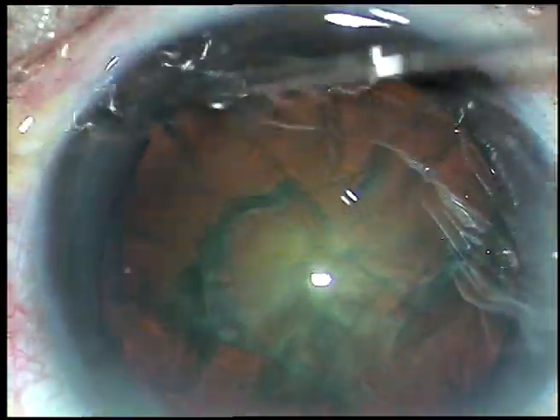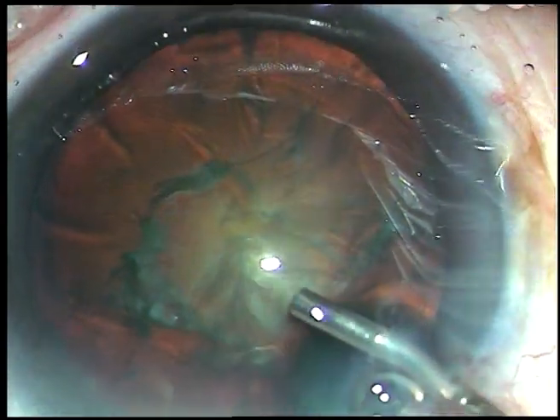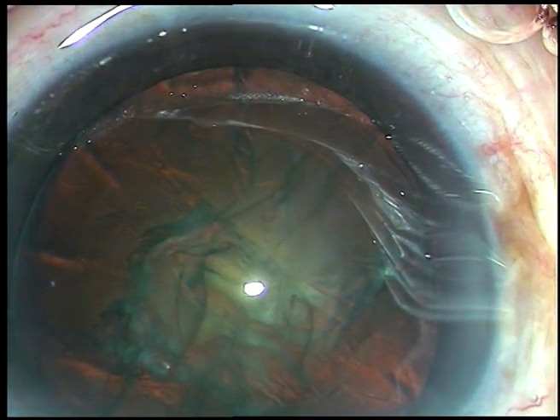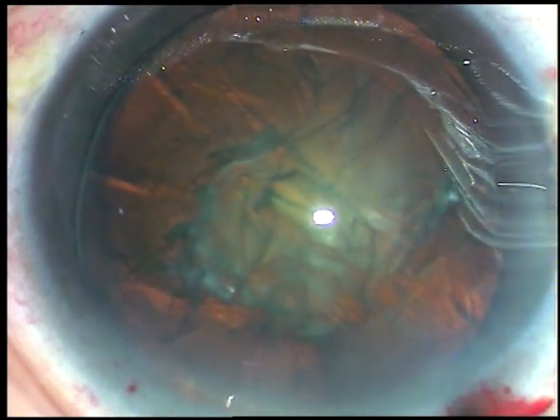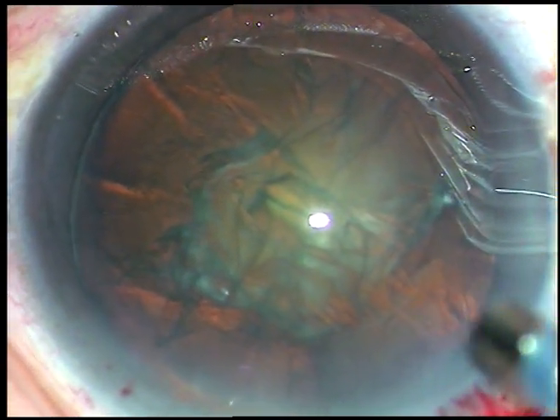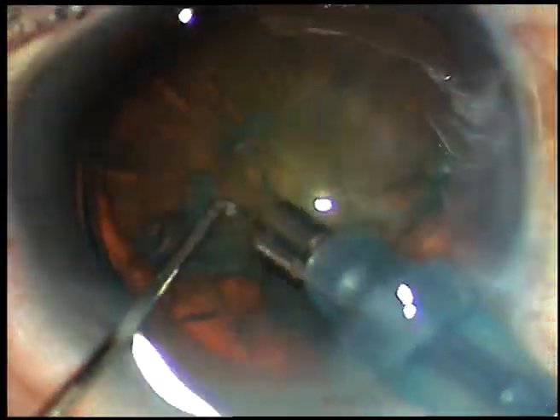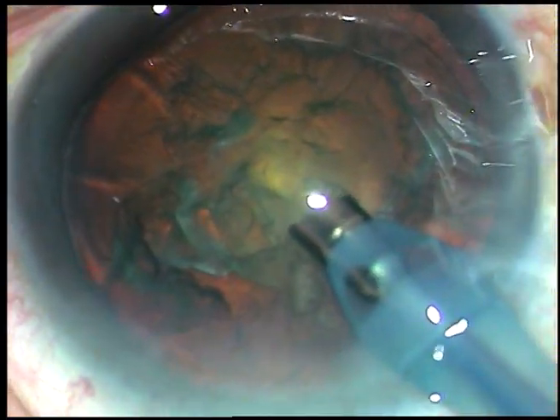The nucleus is tapped and rotated. 2% HPMC is injected again, and now is the time to introduce the tip of the FACO handpiece. The machine being used is the Oertly Cataract-3 FACO machine. FACO power is only 40% in this case, flow rate is 35 ml per minute, and vacuum is 350 mmHg.